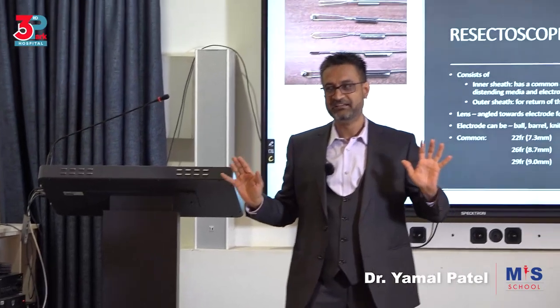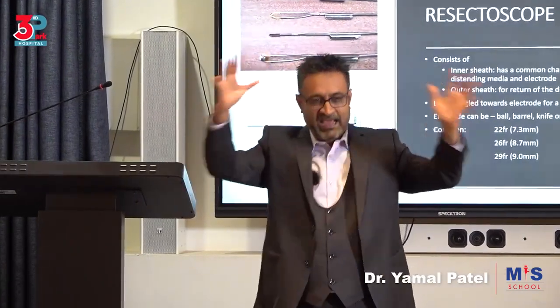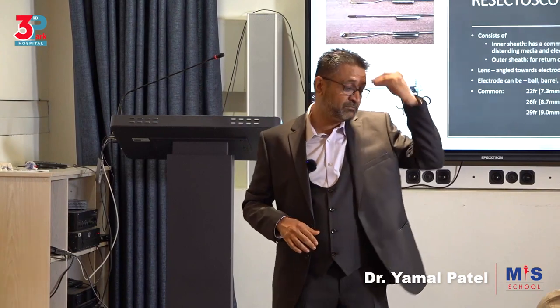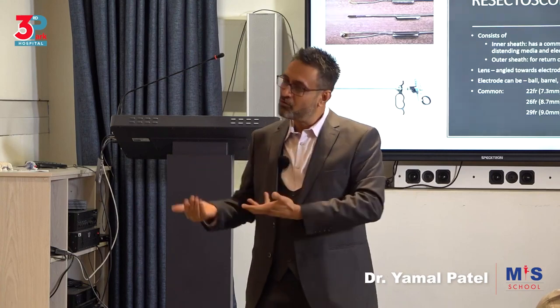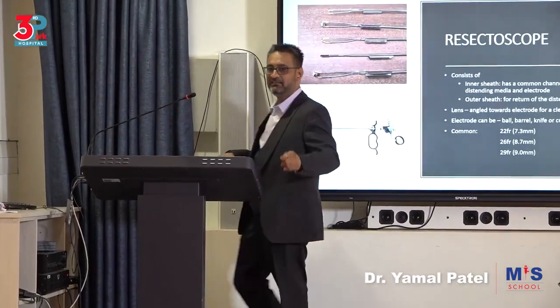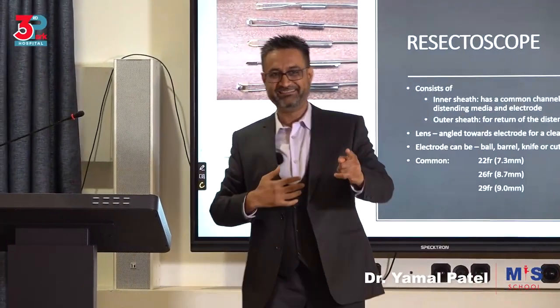So the moment you activate it, the electricity disperses along the whole surface of the uterus and the vagina and wherever the saline is touching. So it's broad out. You've understood? It will disperse into that broad saline curtain around it. So what will happen? Nothing will happen. It will never work. You can increase the power as much as you want, it will not work. You'll think the machine is spoiled, but it's actually because you're using a monopolar in saline. You've now got the idea? So it will not burn. But that's the commonest answer I get: it burns the patient.